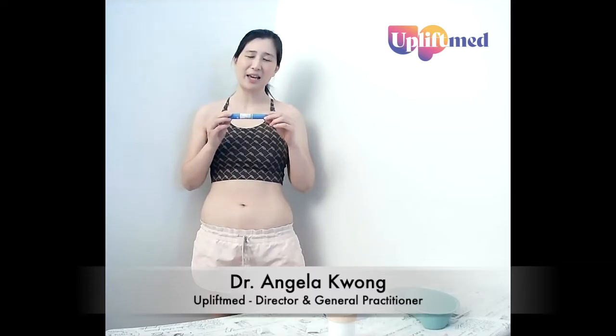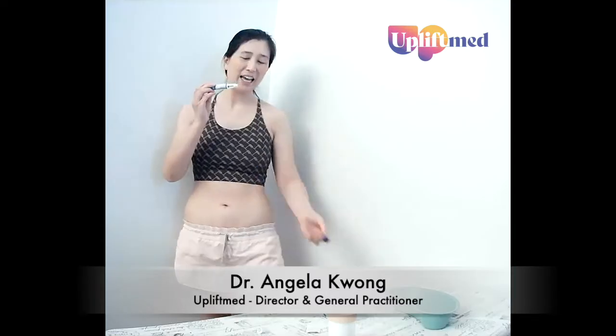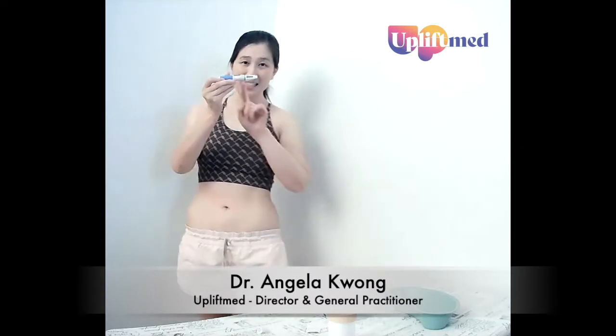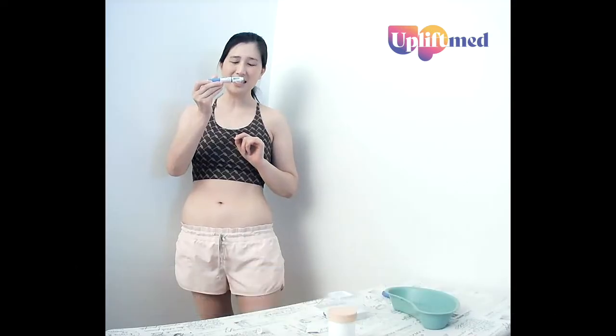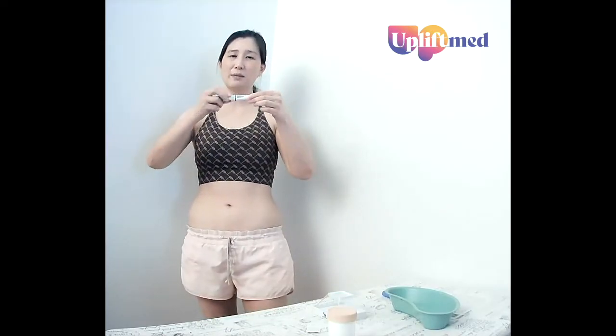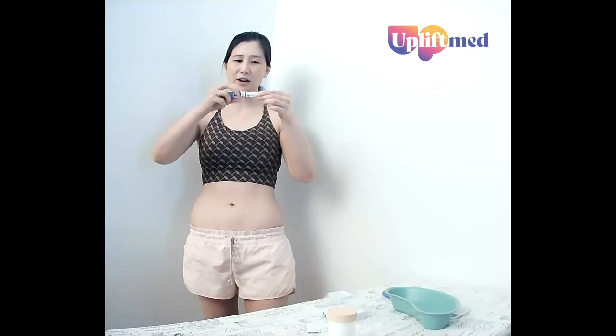Every time you get a new pen, remove the lid and check that the fluid inside is clear and colourless. The next thing you want to do is attach your needle. Get your needle tip, remove the paper covering on the outside. Be careful, there's a needle inside, so don't prick your finger. Attach it so that it's secure, but it doesn't need to be super tight.